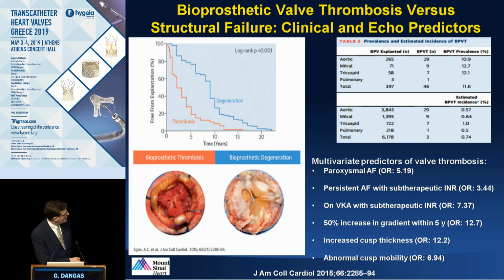If you look at the bottom left, it seems a little obvious. The red is thrombus, the white and yellow is not thrombus. Unfortunately, CT scans don't have color. So although in the pathologic sphere you can say, how can you mess it up, it's kind of obvious. Unfortunately, in non-invasive imaging we really cannot see that difference, and hence we're always a little puzzled. Is it a potentially reversible thrombus, or is it more of an organized pannus that has nothing to do with thrombus? And interestingly, could thrombus be the underlying mechanism that over time develops into pannus? That's another aspect we need to be attentive to.